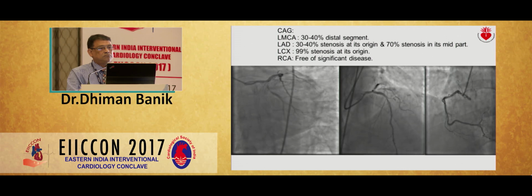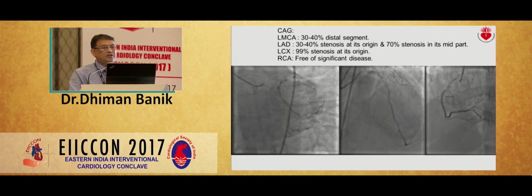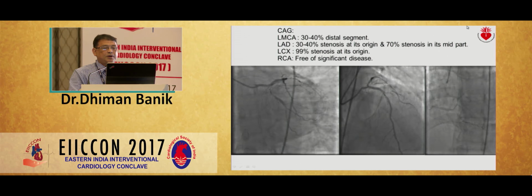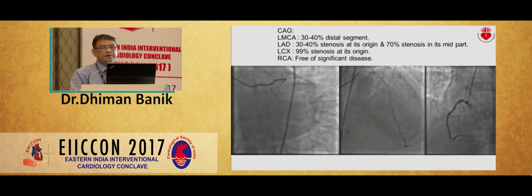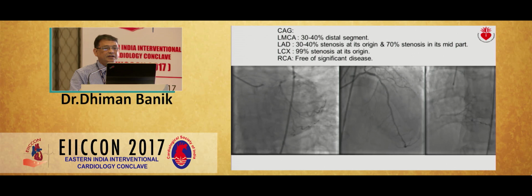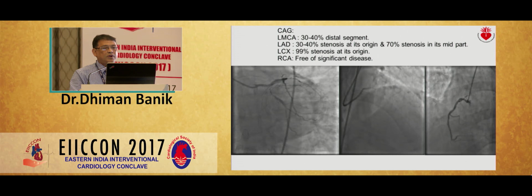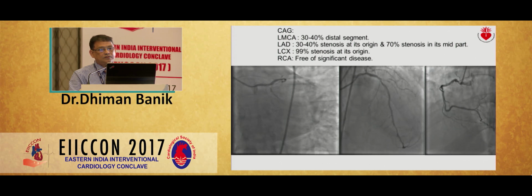Angiogram reveals there is a slight tapering of the distal left main, around 30 to 40%. The LAD has a slight tapering at its ostial part, origin, and a mid-segment 70% lesion. The LCX has a tight lesion of 99% at its ostium. RCA is free of significant disease.